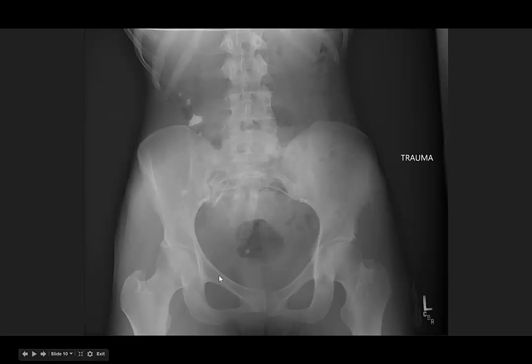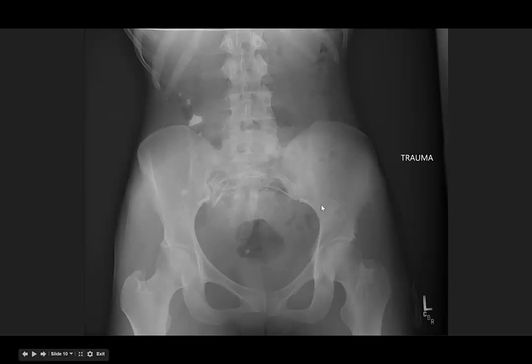Go all the way around the ring — you should not have any irregularity in this ring. Following the system out the rest of the way: posterior acetabulum looks good, acetabulum on both sides looks good. Take a look at your inner rings, your ischial and inferior pubic rami.